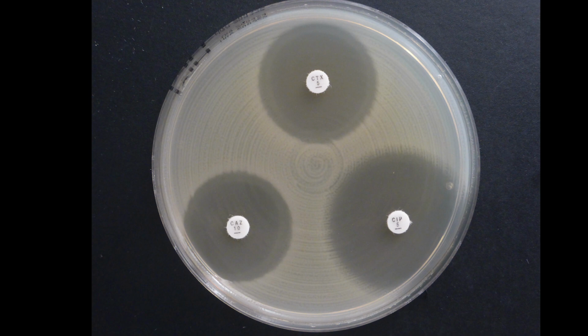And then you have to decide how many isolates or strains we should have, how many antimicrobial agents, and that of course depends on the opportunities that you have. If it's a smaller group and more a research lab or a specialized laboratory, maybe you can add more isolates and more antibiotic agents. When we have performed reading exercises in our routine work, we have tried to limit it to 2 isolates. Those could be clinical isolates, but it could also be QC strains, and only 4 discs per plate, because we want it to go quite fast when we read those zones.